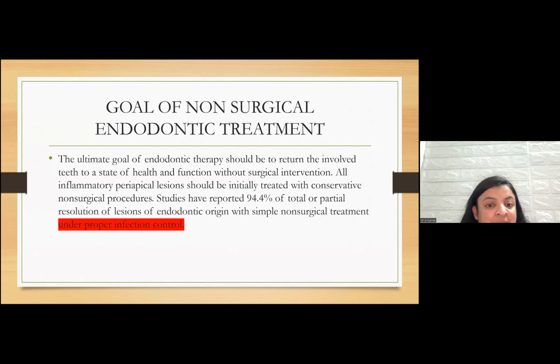Whatever resources we have, we need to use. I've seen many people not using rubber dam. I've seen many people not disinfecting canals properly. Here again can be a reason for reinfection. Without rubber dam, we should not do any root canal treatment, even a normal one, because no endodontic society will accept any root canal treatment without rubber dam. You cannot achieve proper infection control without rubber dam.